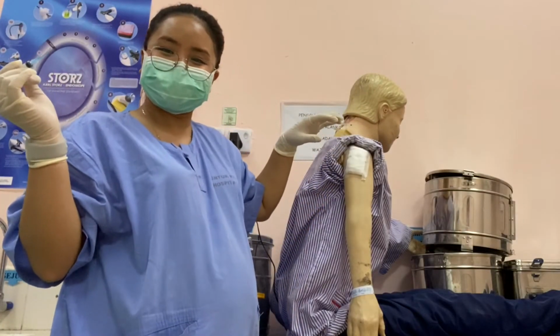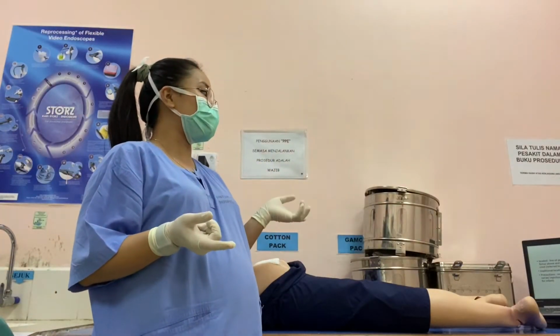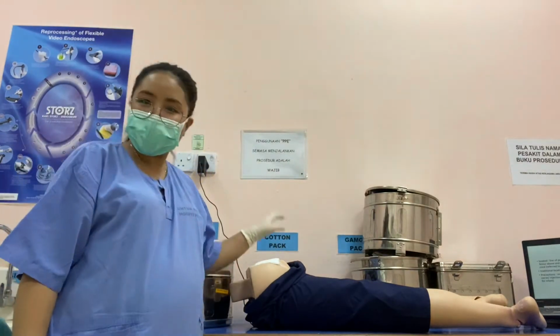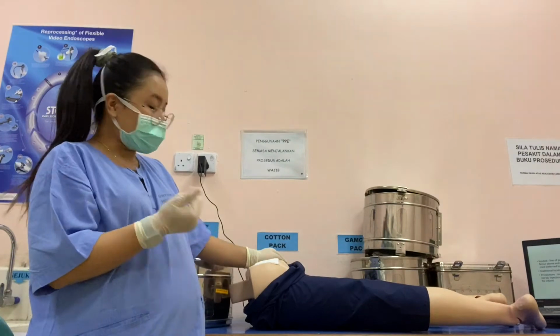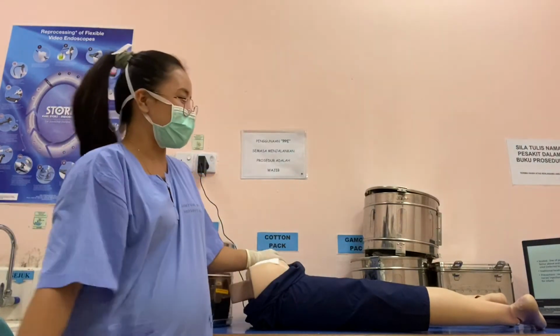Easy, isn't it? So next, we are going to the dorsogluteal site, which is located at our buttocks. So this is Mr. John's buttocks, which I have already separated from the body. So I'm going to show you the side of the buttocks.